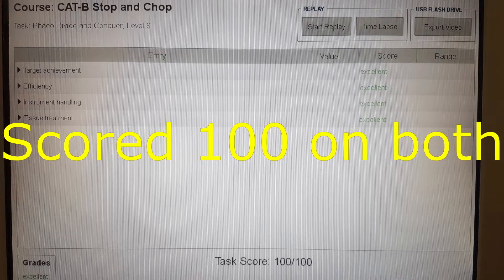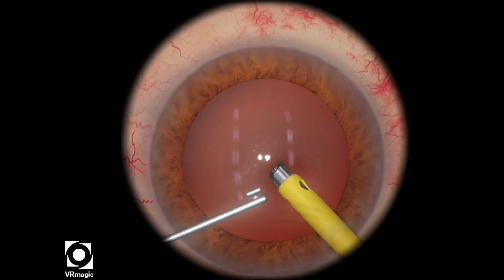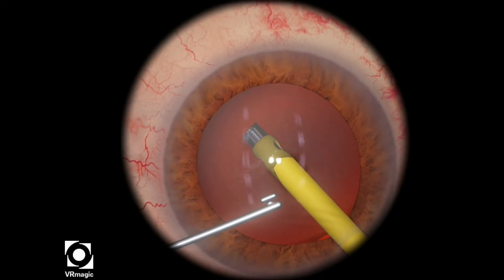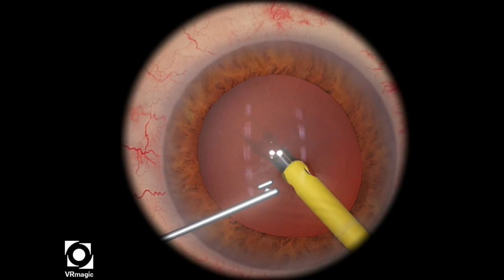So I scored 100 in both attempts. Here's an example of what you really shouldn't do. If you use too much ultrasonic energy, you will actually get a much lower score.